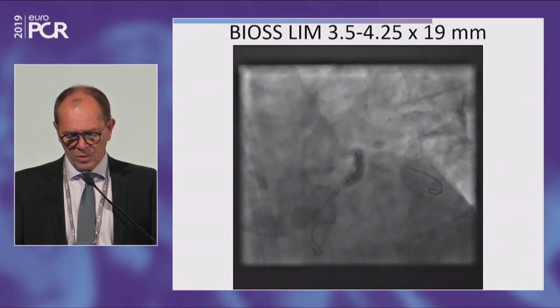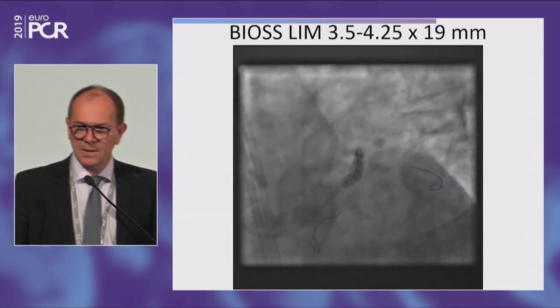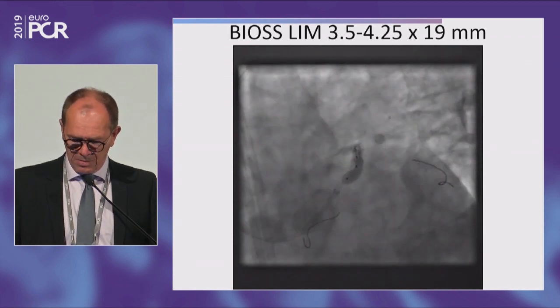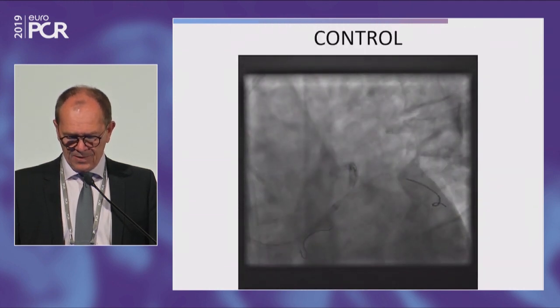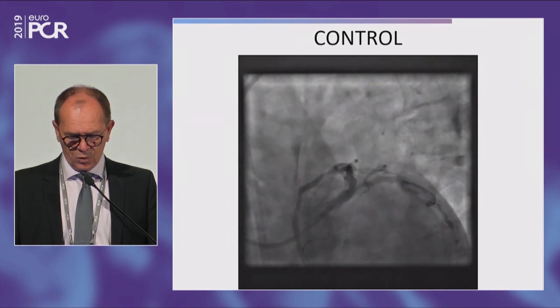I choose to put another wire, could be a part also of the discussion. In routine, I don't use it now with this guy, maybe because due to the amount of the calcification, because maybe that was the beginning of the experience. Finally, this is the aspect after the delivery of the stent at 12 atmosphere.